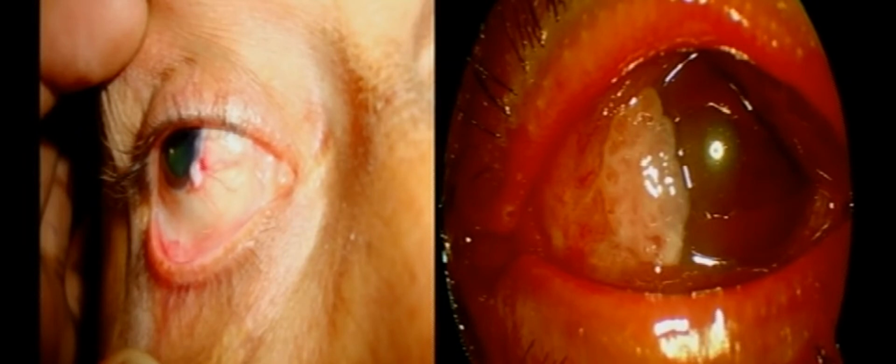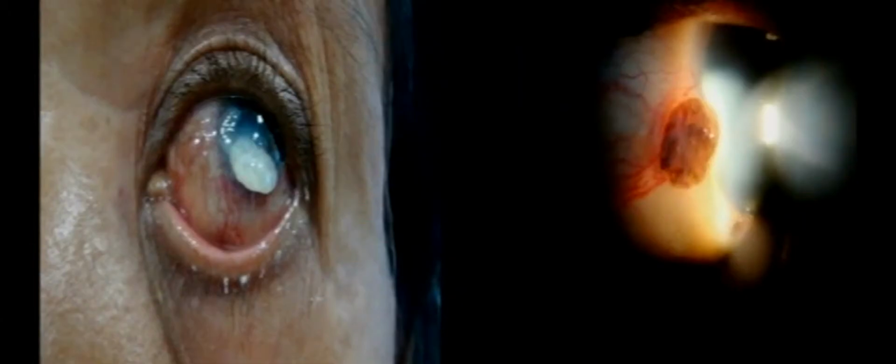This was already covered, these are some of the OSSN pictures. Again, a whitish one and a pigmented one can be a squamous cell carcinoma. What is important here?